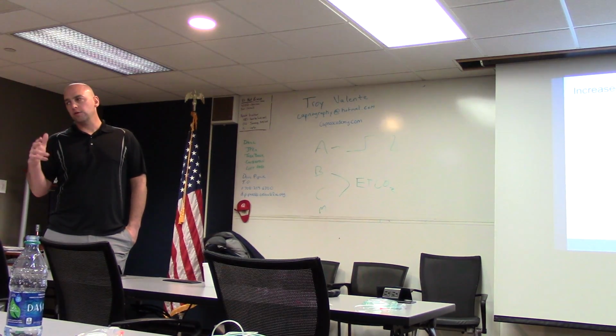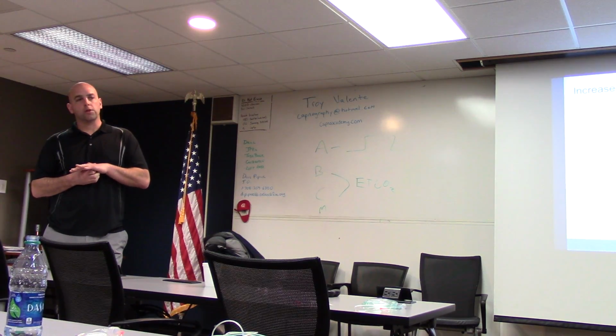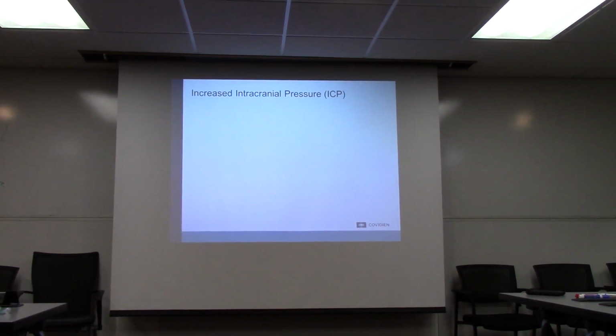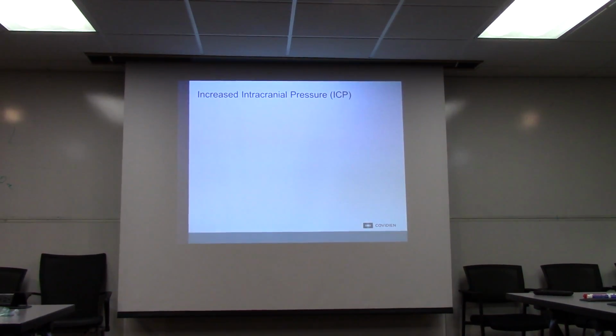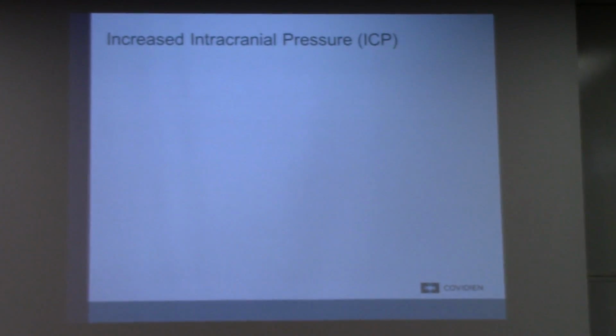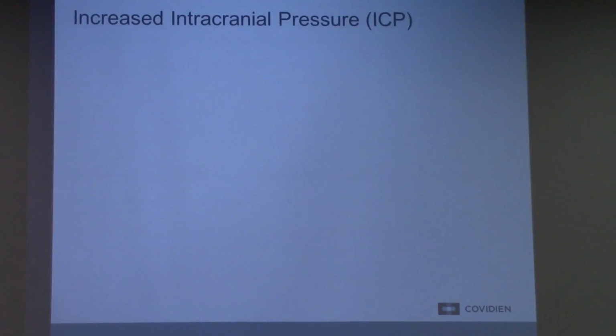The reason I'm repeating this over and over again is this patient is the exact opposite. The closed head injury ICP patient, we change how we ventilate a patient to achieve a specific range. So we got to make sure we don't get them confused. If they're dead and they have no perfusion themselves, strict 10, third to half the bag. If it's ICP, closed head injury, this patient needs a specific range. And we're going to understand that right now.